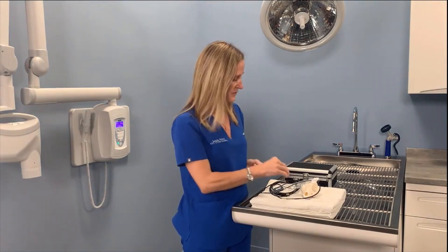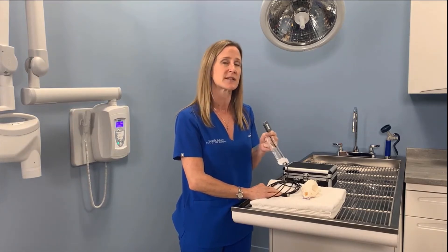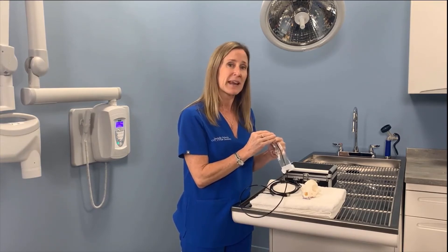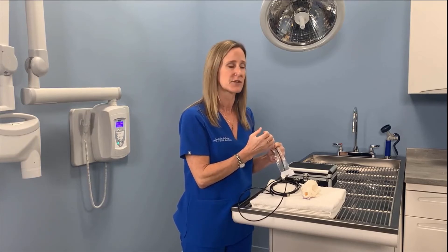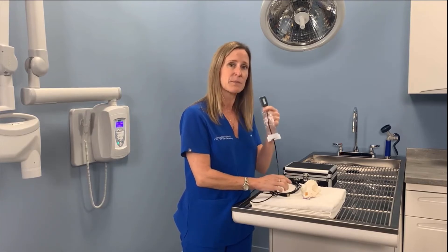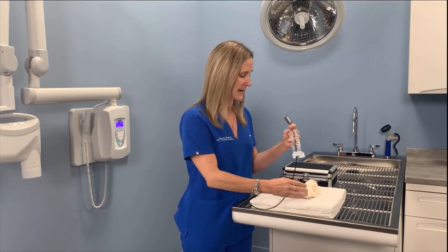One of the things that's really important when doing dental x-rays with this sensor is that your patients have to be on a surgical plane of anesthesia before this can go in. This is a very durable sensor, but it can be damaged if a patient wakes up and really bites down on it. So it's very important your patients are on a surgical plane of anesthesia, and you'll keep this sensor for a very, very long time.